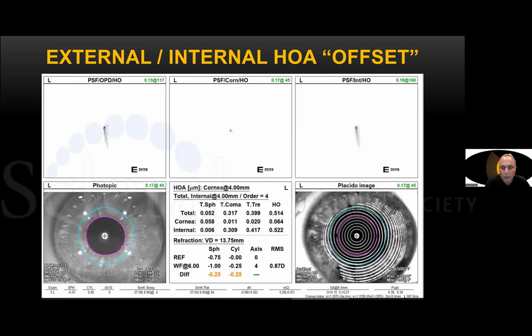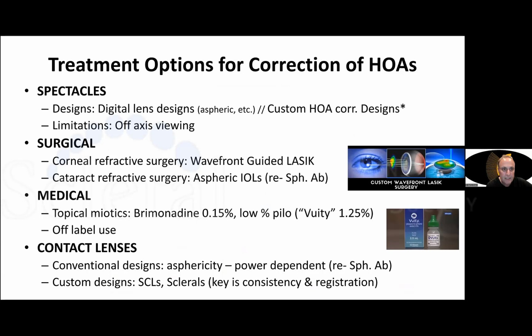Now we put that scleral lens or rigid lens on the eye. Look what we've done to the internal: nothing. What we've done to the anterior corneal: eliminated it. And look what residually happens. Patient's going to be miserable with this level of vertical coma.